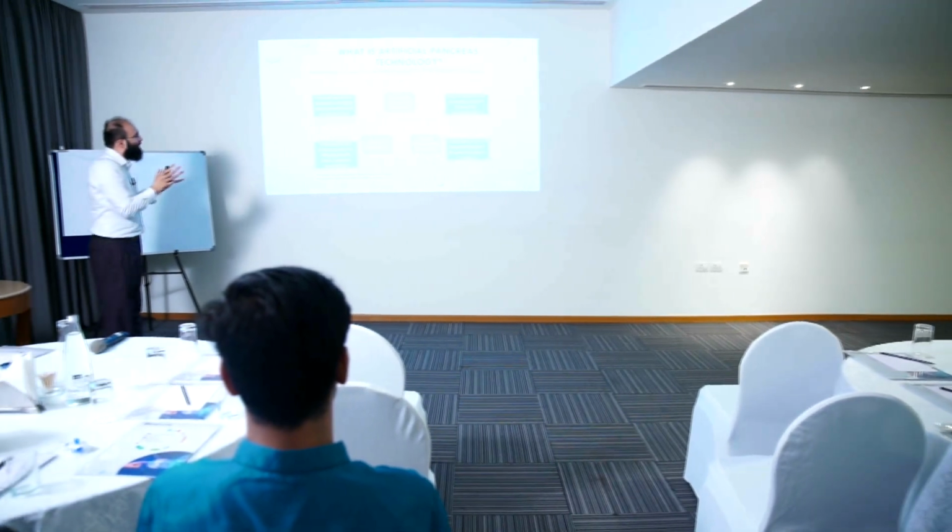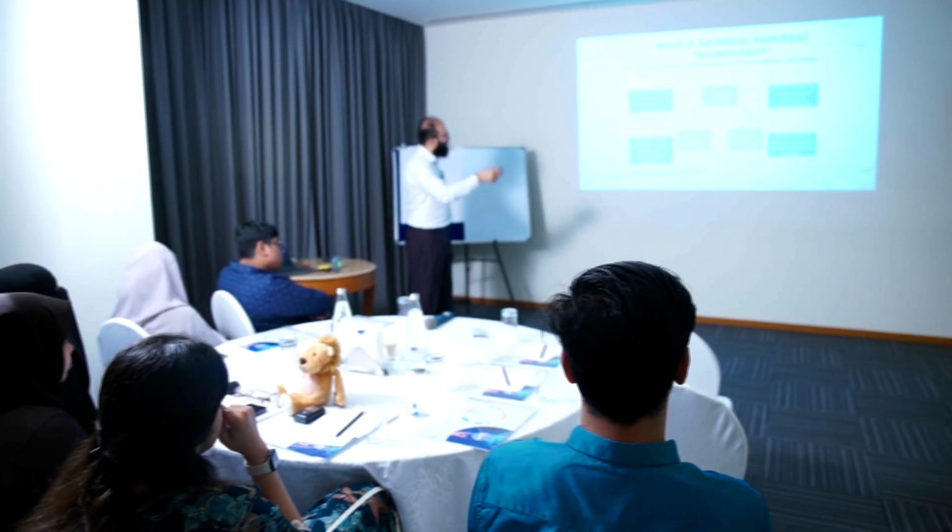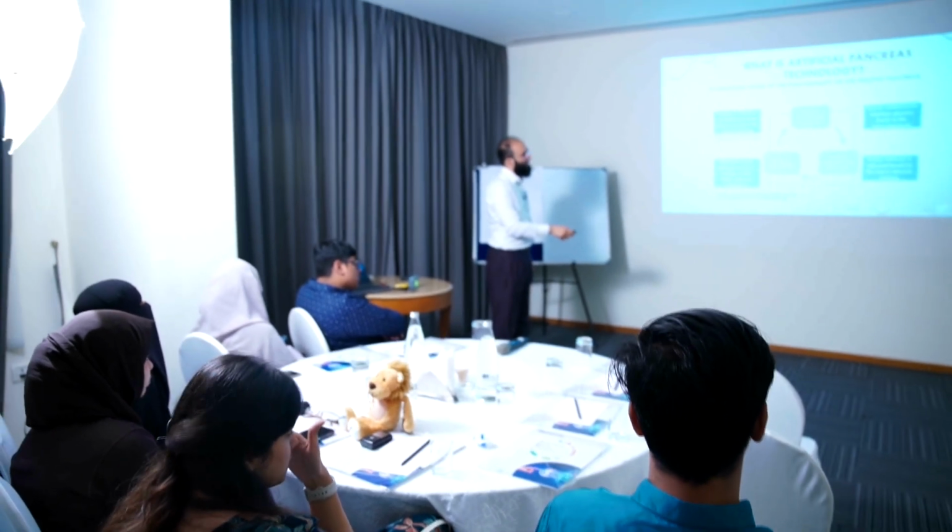What is artificial pancreas technology? By mimicking some of the functionality of a healthy pancreas, we are trying to close the loop. So the body's response: glucose is continually sensed and insulin automatically adjusted. The sensor continuously monitors glucose levels in the interstitial fluid. Insulin delivery is adjusted based on the sensor glucose reading. Adjusted insulin delivery results in changes in the body's glucose metabolism. Changes in glucose metabolism impact glucose levels in the interstitial fluid. So this continues. And Paradigm Veo, the first artificial pancreas technology, low suspend.